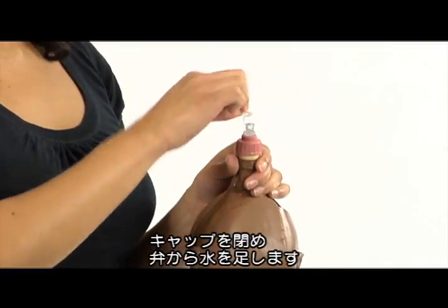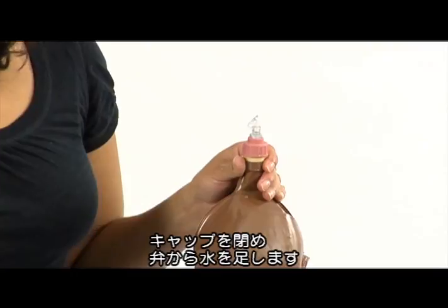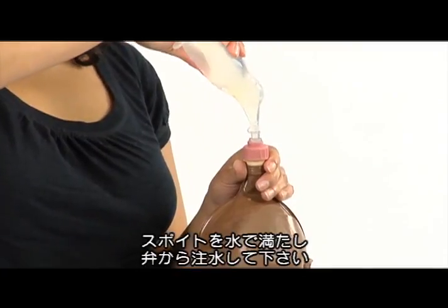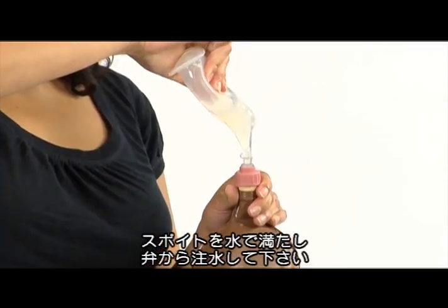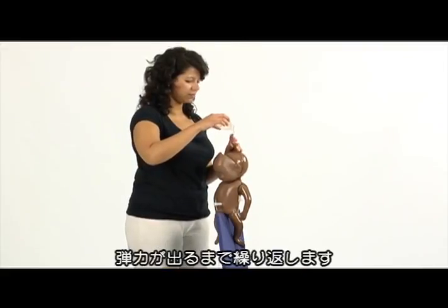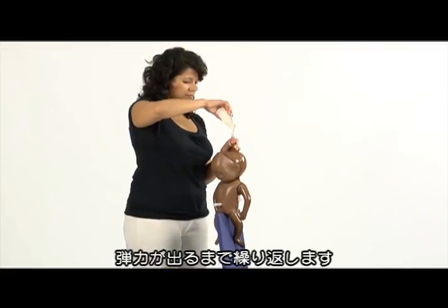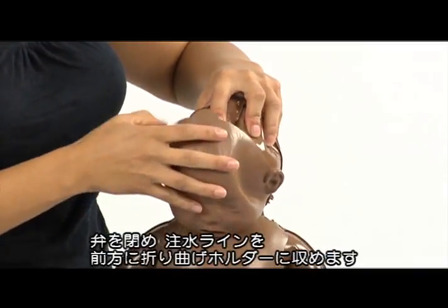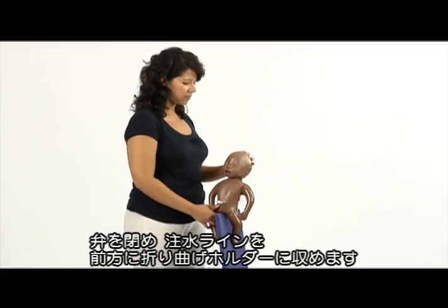Return the filling cap and open the valve to fill it with more water. Fill Neo Natalie suction or another suitable irrigation device with water. Insert it into the valve and press. Repeat this step until the body feels firm. Close the valve and fold the filling extension forward. Push it under the face skin until it clicks into the holder.